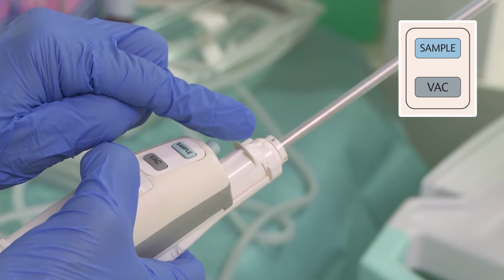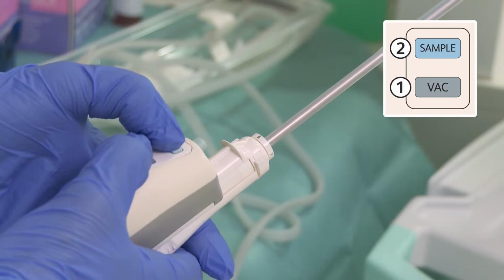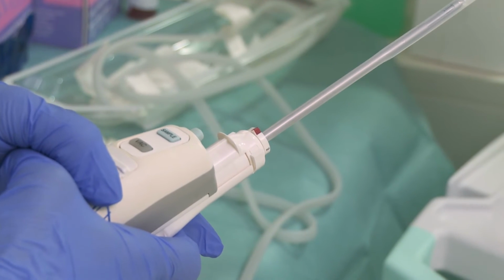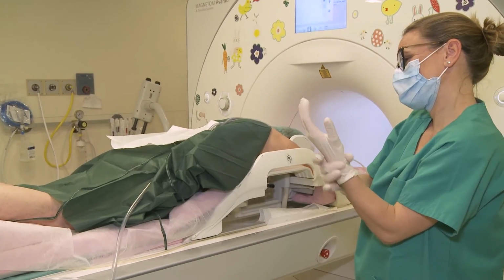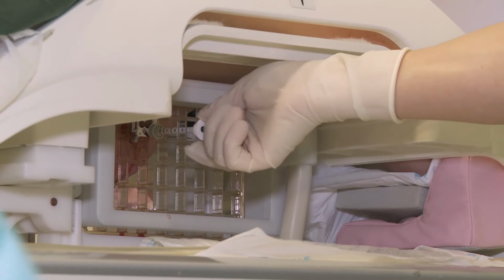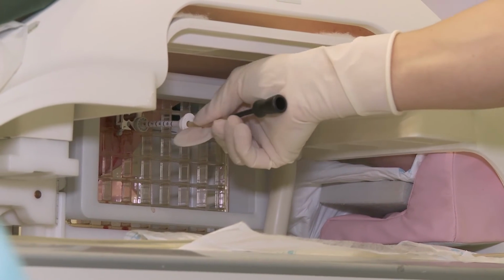VAC, quickly followed by sample driver buttons, are pressed to rotate the notch 180 degrees so that the 12 o'clock sample faces towards the chest wall in this case. VisiLock obturator is removed while keeping the cannula and the cannula stop in place.